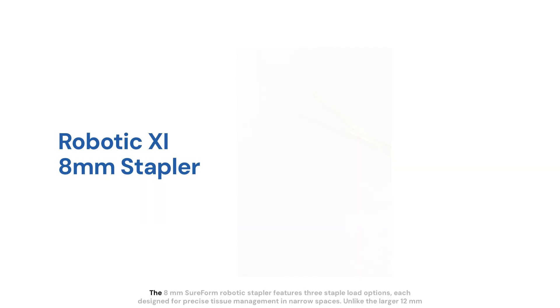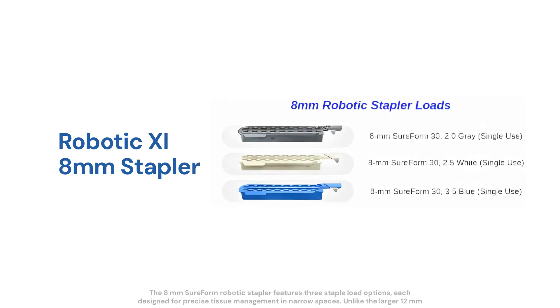The 8mm SureForm robotic stapler features three staple load options, each designed for precise tissue management in narrow spaces. Unlike the larger 12mm staplers, the 8mm system does not offer green or black loads, meaning the thickest available staple size is 3.5mm.